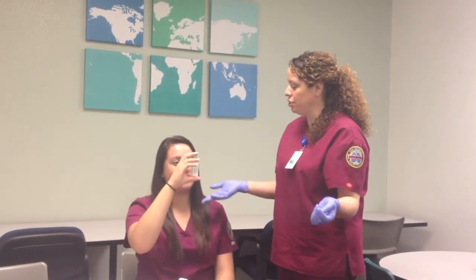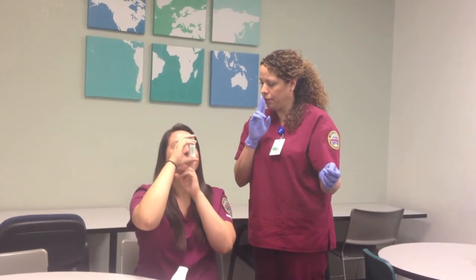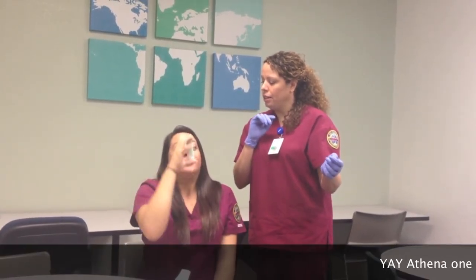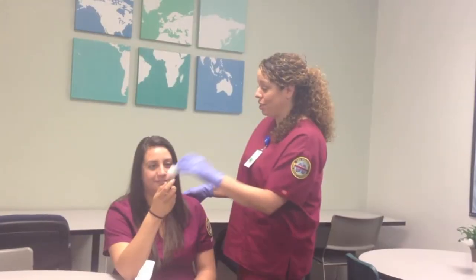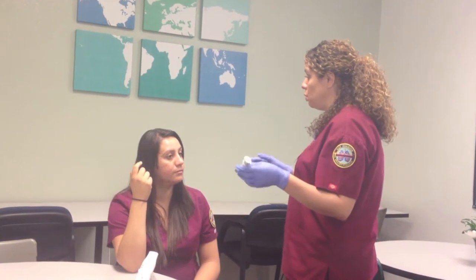Go ahead and tilt your head up just a little bit. Two fingers. Place the inhaler. Now start to breathe in. Press down. And hold. Great job. So you did really well with that. Now the doctor has ordered two puffs, but we want to wait about two to five minutes in between each puff.